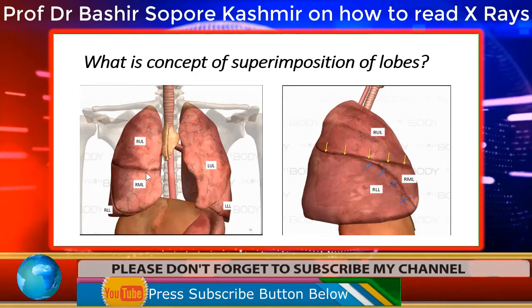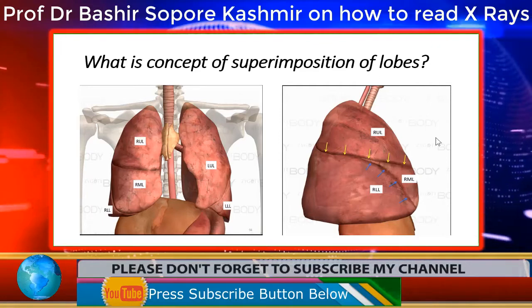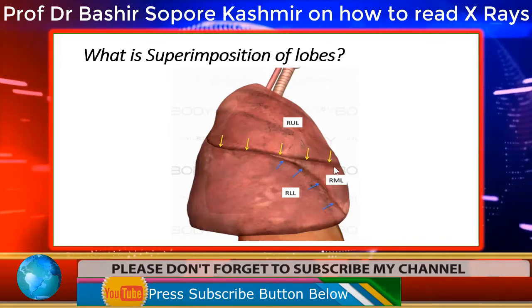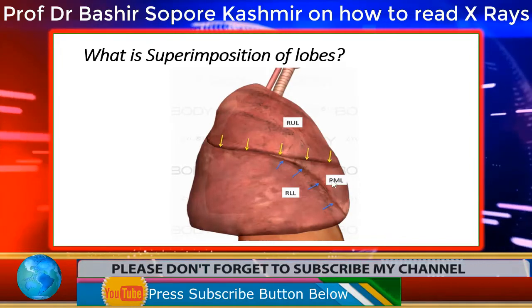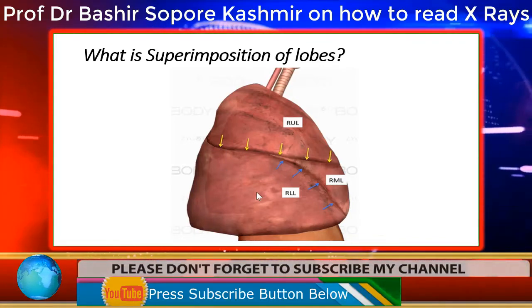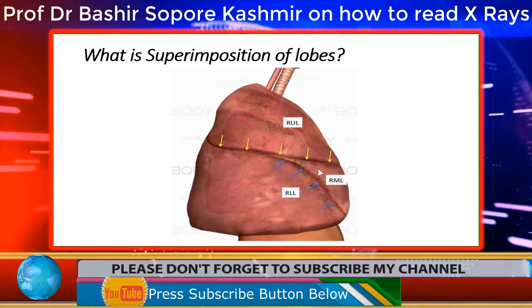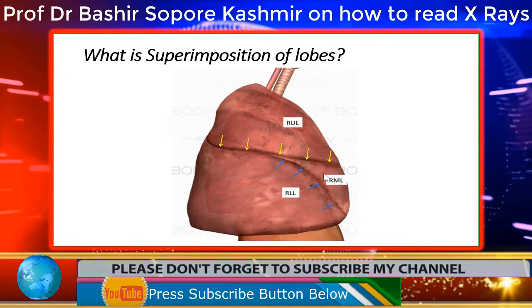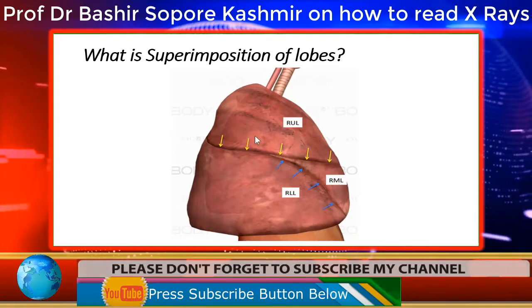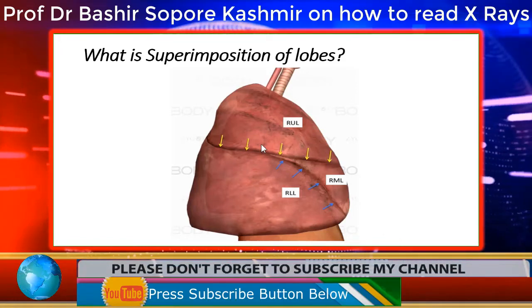I think that is correct as far as superimposition of lobes is concerned. Or if there is only the middle lobe, suppose this is the middle lobe, if only the middle lobe is involved, then this will be totally dark because this is normal. So at that time, we will be only seeing the middle lobe as radio opaque on the X-ray, and the rest of the lung will be dark due to air in the lungs.